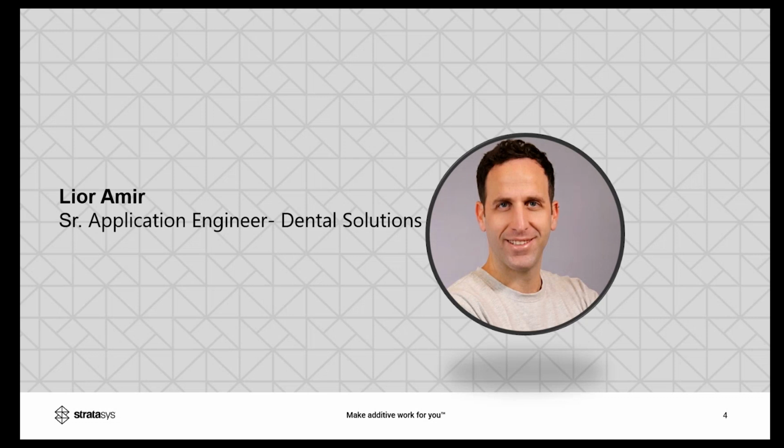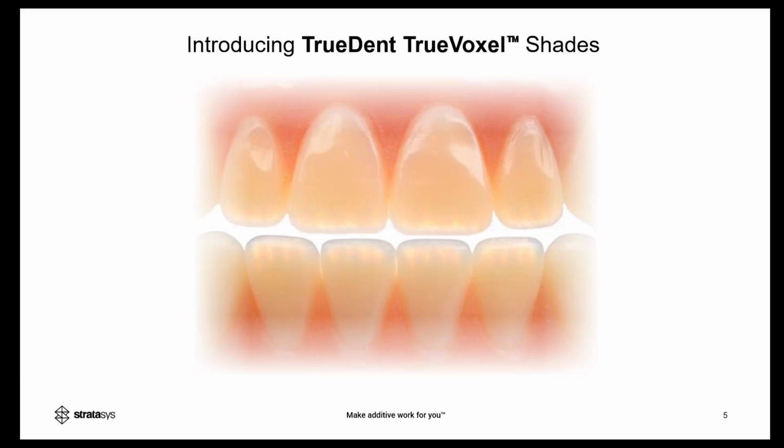And as Adrian mentioned, me and a large group of smart people, not myself included, worked on this project to get the best aesthetics we can achieve with TrueDent, trying to even improve the level that we had so far. Robert is on the line here that worked hand in hand with us, and a group of R&D engineers. This is TrueDent True Voxel shades.